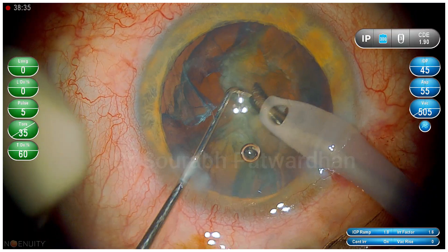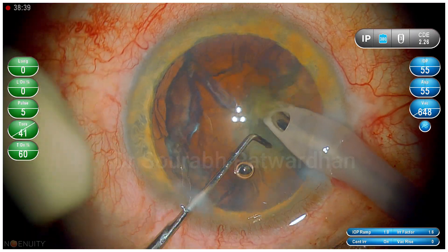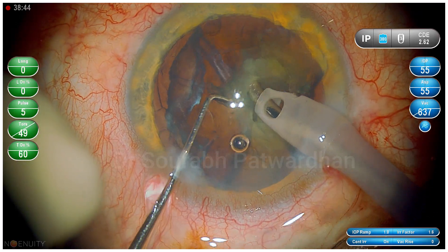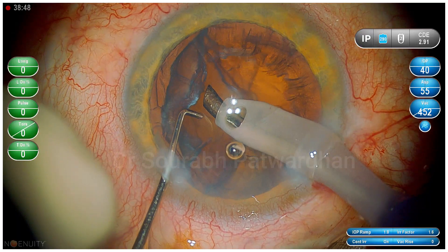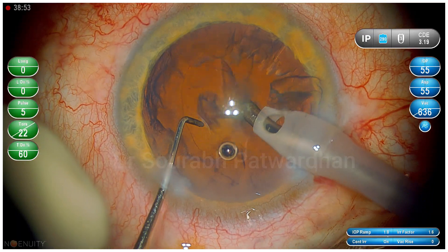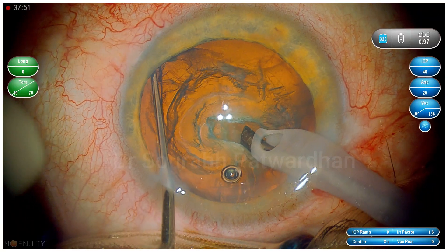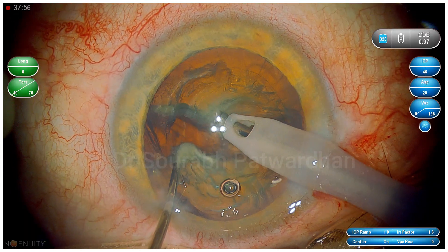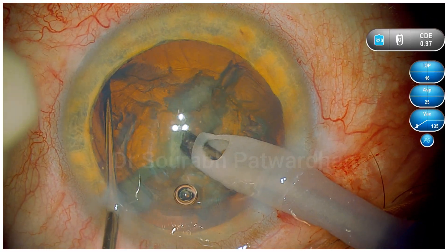When you watch this surgery, I am sure you are not going into the details of what maneuvers I am doing during the procedure. But once I come back to this video and highlight things, you will start observing the nuances and details in the procedure. So let's try to observe now — I would like to highlight the safe zone for doing the quadrant removal.